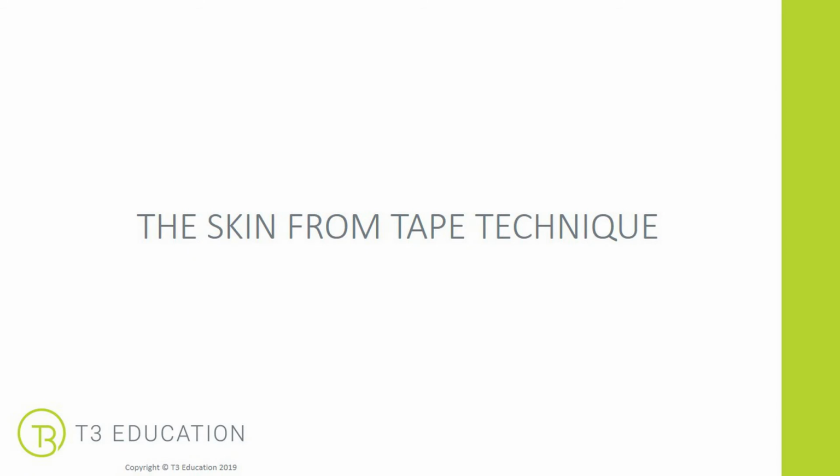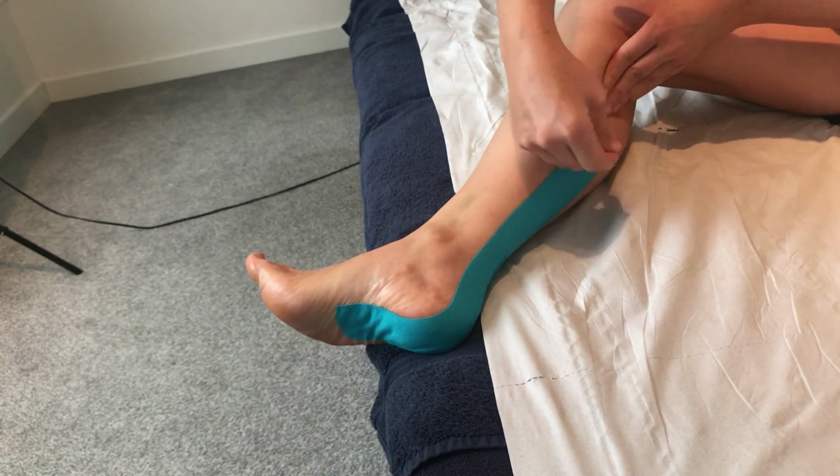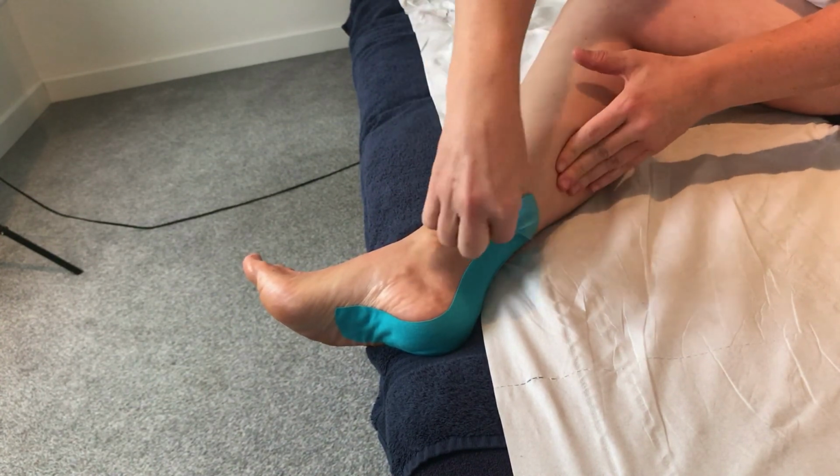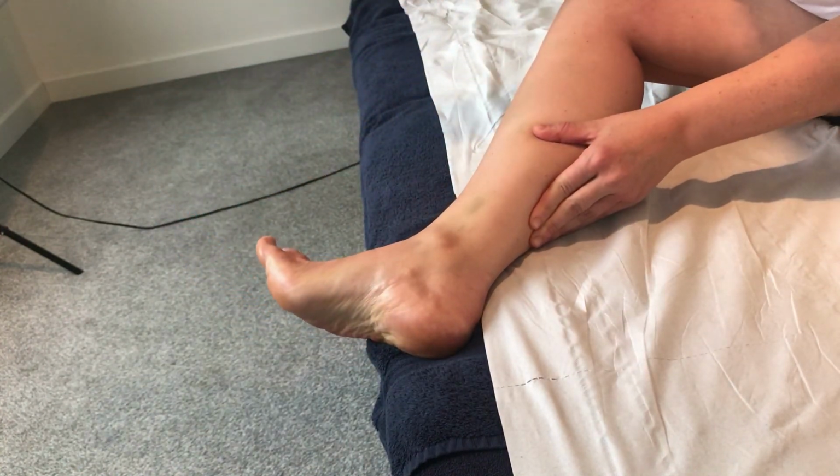The skin from tape technique. This is where you move the skin away from the tape. So using your fingers to create a stretch on the skin as you ease the tape off. And as you're easing the tape away from the body, the hand that's stretching the skin moves down towards the edge of the tape.